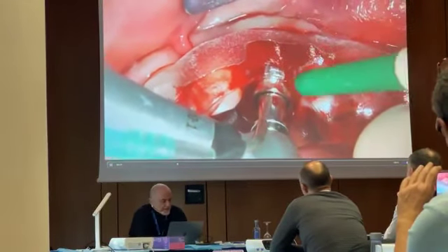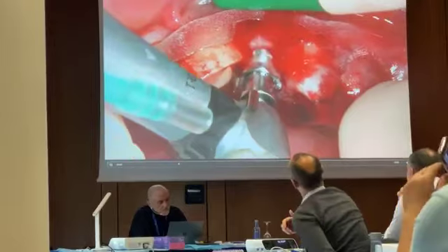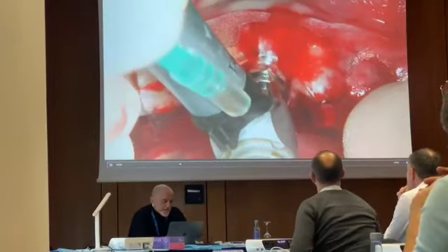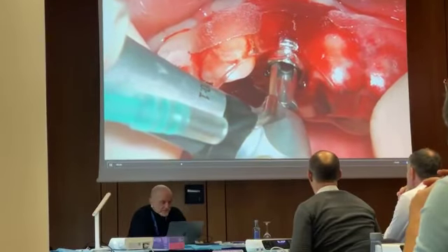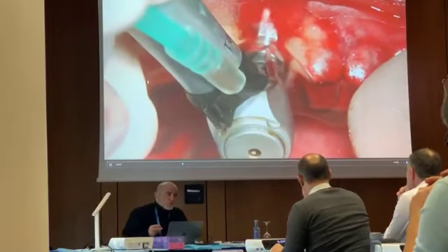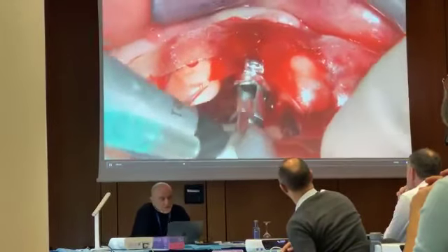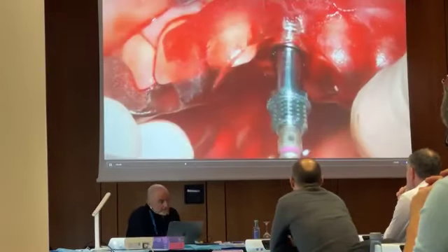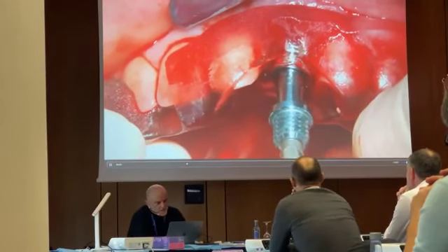Now it starts the atraumatic implant placement, which is completely guided. I have to tell you that the Prima system provides us many different steps for preparing the site, which means minimizing the trauma to the bone and to the adjacent soft tissue, so you don't use only 1, 2, 3 burrs like it is suggested in other systems, and so you progressively increase first the length and then progressively the diameter, and this will really minimize the trauma to the bone and to the tissue.